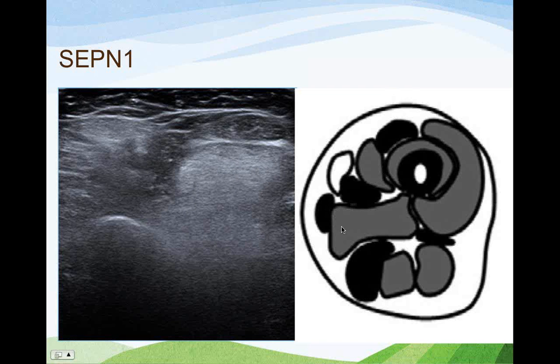And this actually correlates with schematics that have been drawn in that recent TREAT-NMD paper about the patterns of muscle involvement with the different disorders. So here you can see that just with the muscle ultrasound, you can identify that this white sartorius, meaning it's the most affected, is right here. Gracilis, dark, less affected, actually least affected, right here.